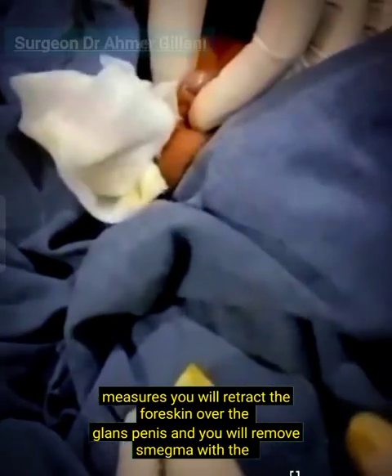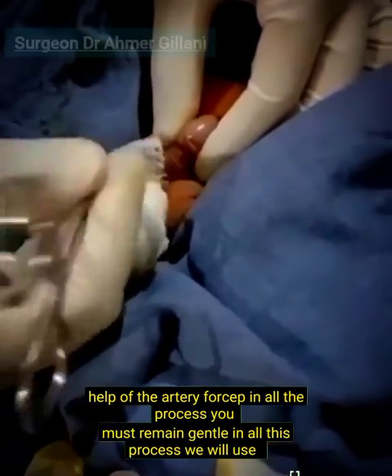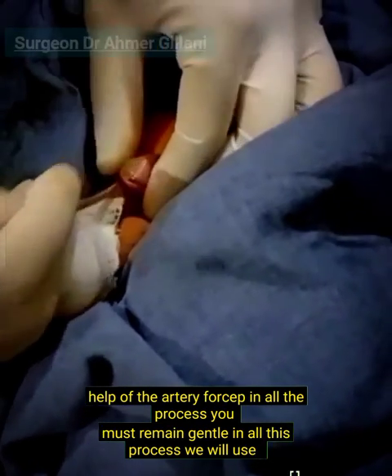You will retract the foreskin over the glans penis and remove the smegma with the help of the artery forcep. In all this process, you must remain gentle.